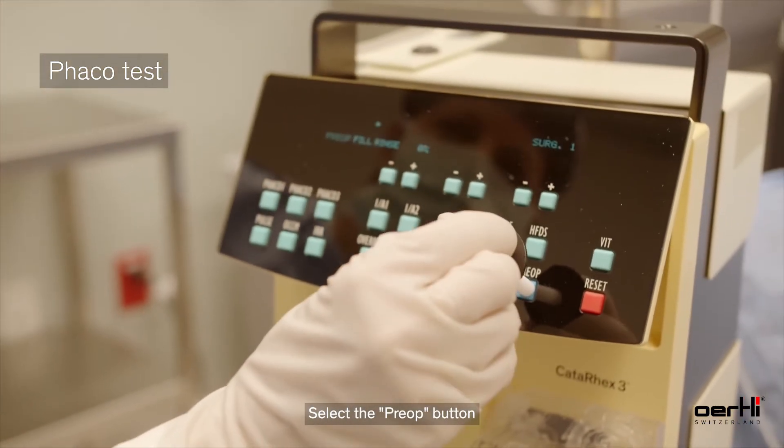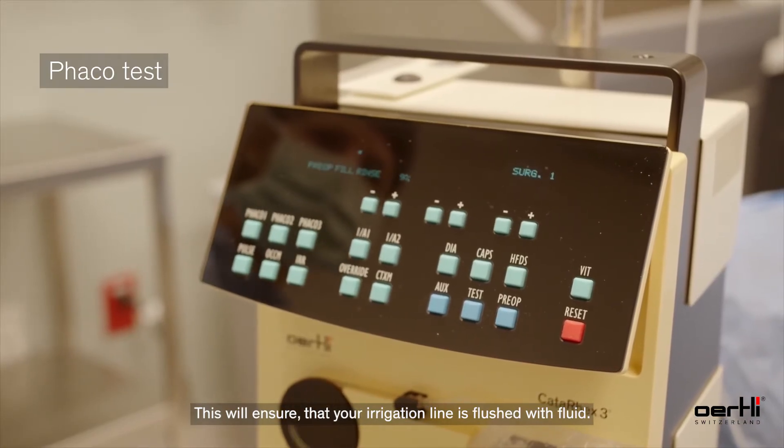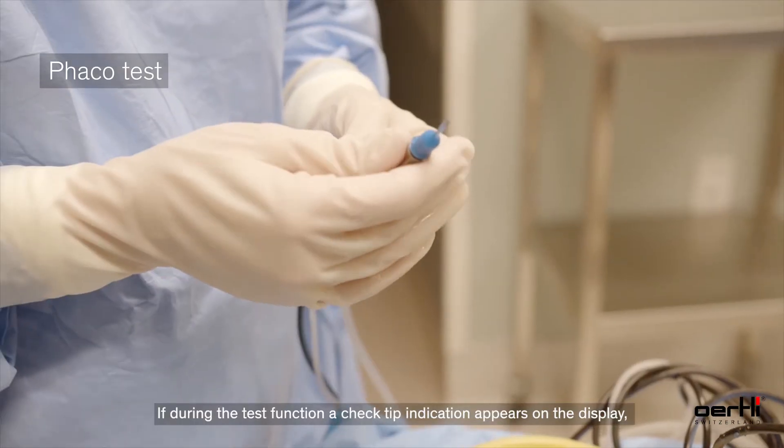Select the pre-op button. This will ensure that your irrigation line is flushed with fluid and the system will then be ready for use.